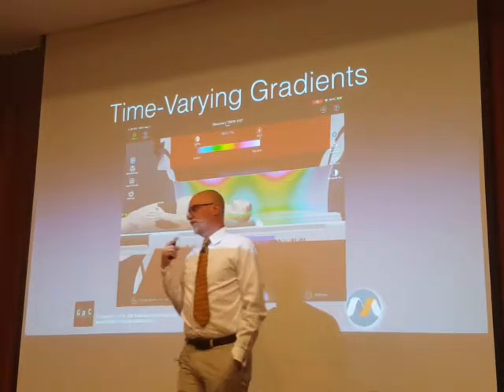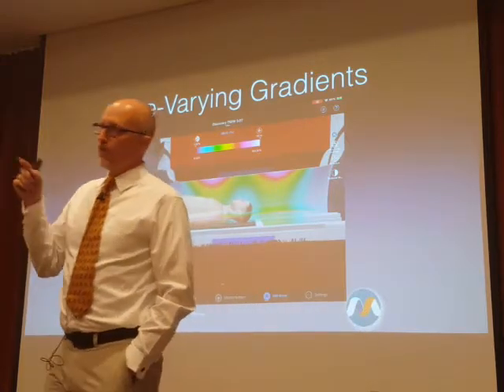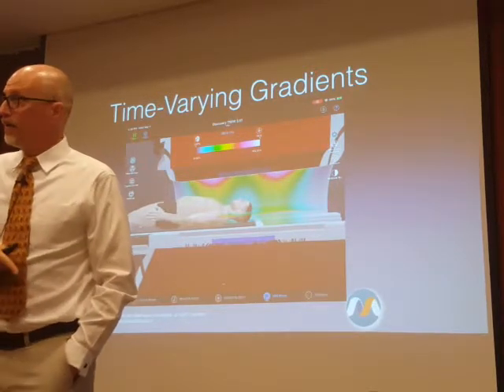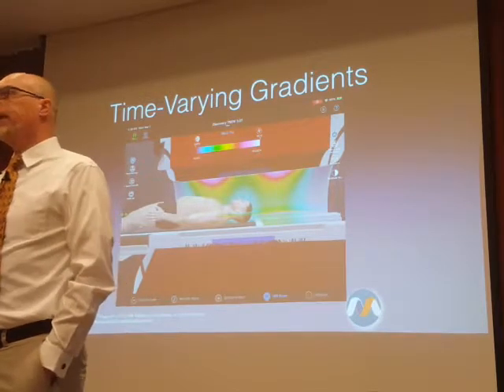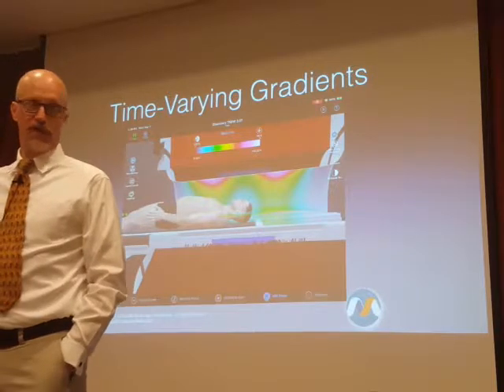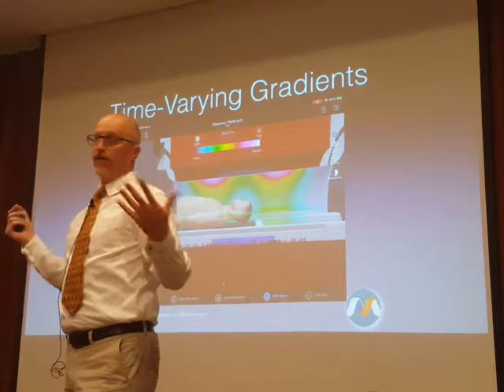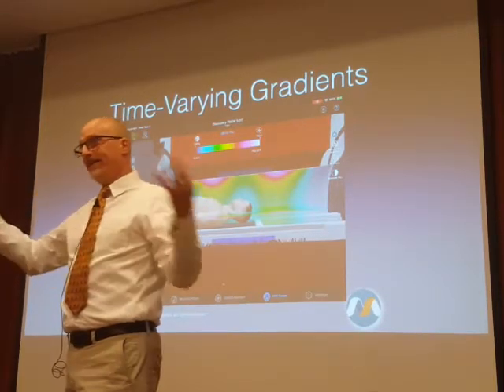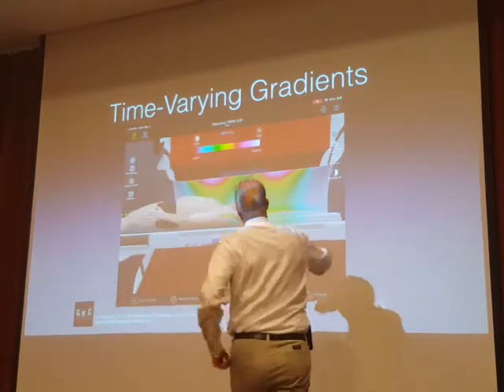So the experience of peripheral nerve stimulation is almost never where we're taking the picture. If we're imaging the patient's head, we're very unlikely for that patient to experience peripheral nerve stimulation anywhere in their head, because that's where gradients are close to 0. Where they're greatest is 30 to 35 centimeters, either superior, inferior, or radially, away from isocenter.